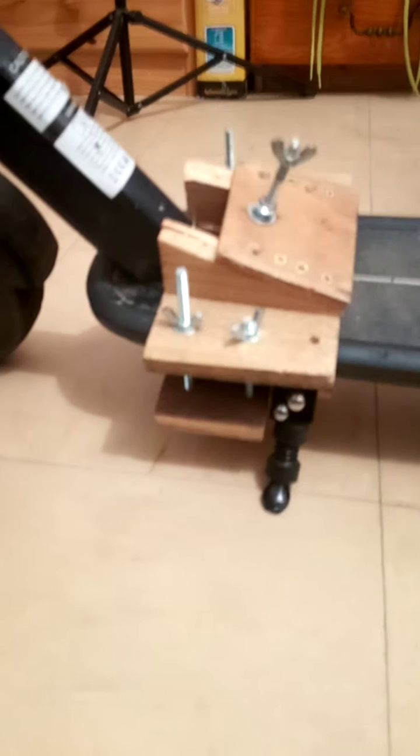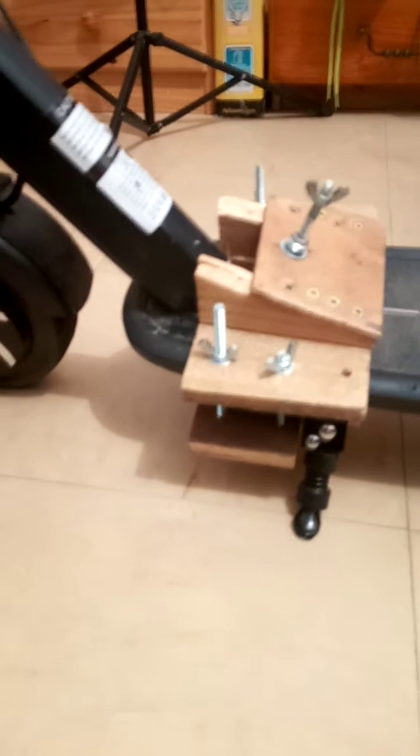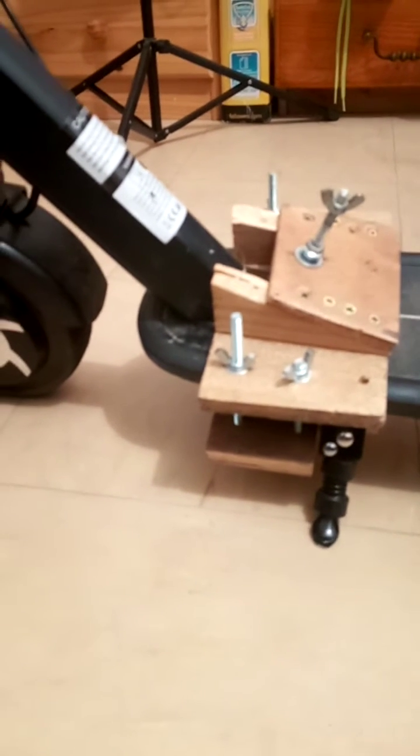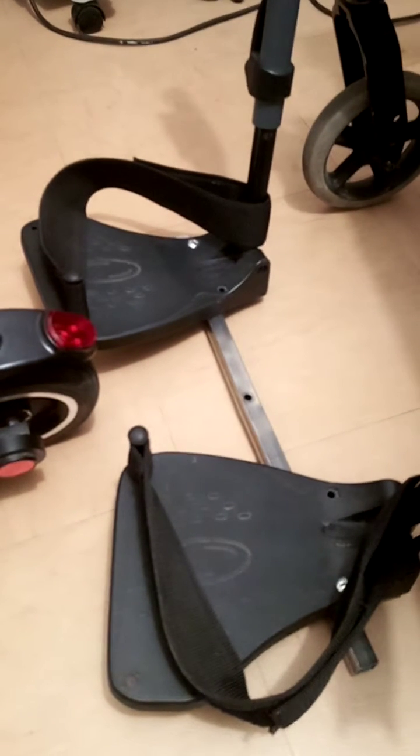It's fairly self-explanatory. The hardest part was getting the angle for the plate for attaching the wheelchair. The adaptation for the wheelchair is just a bar across the footplates, so that the chair has got something to rest on.